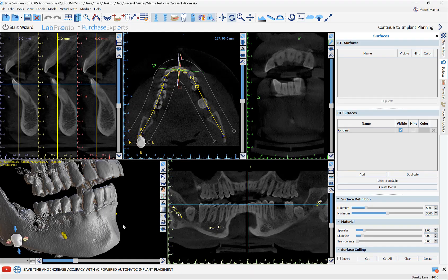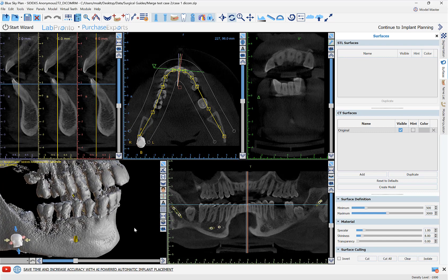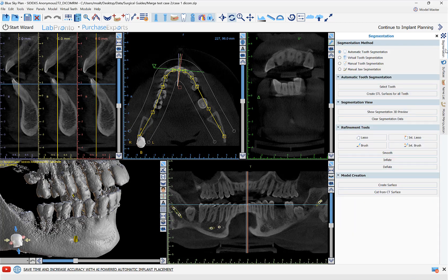If you're going to be extracting a tooth and placing an implant and you want to remove the tooth from the 3D CT data, the process is super simple. Switch over to the segmentation panel and go to automatic tooth segmentation.